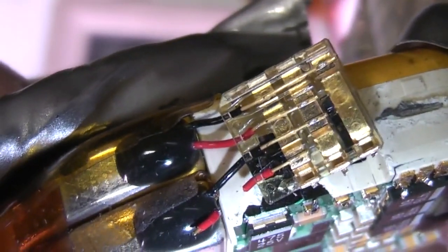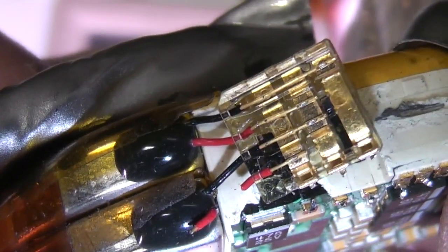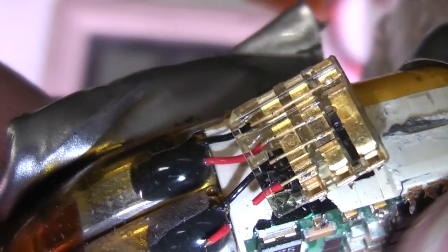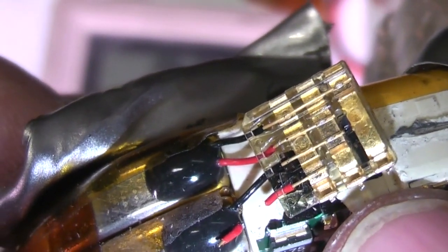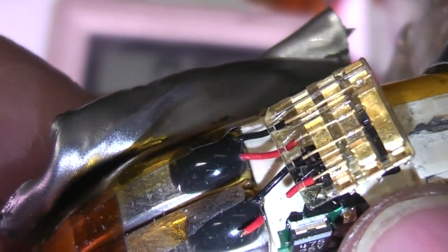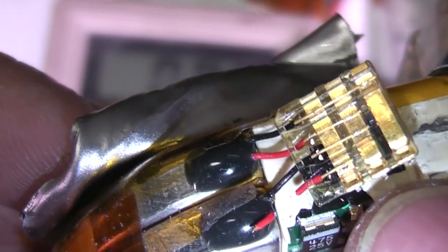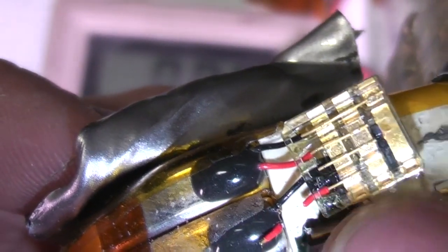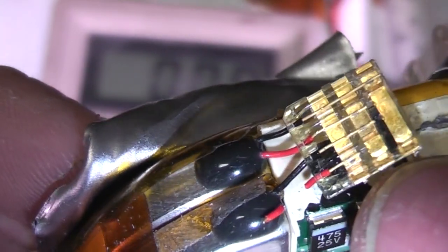Just looking at how these are wired, these appear to be wired in series, whether that's just to increase the voltage rating or whether maybe it can decide whether to use one or both of them, or maybe it does bipolar waveforms or something, I don't know. You can see those sensor positive and negative ones go to the same bar.